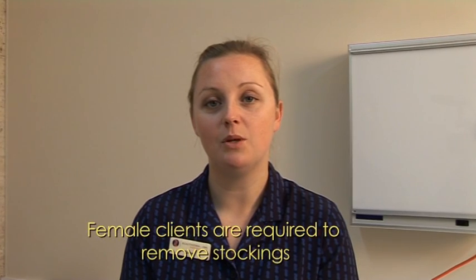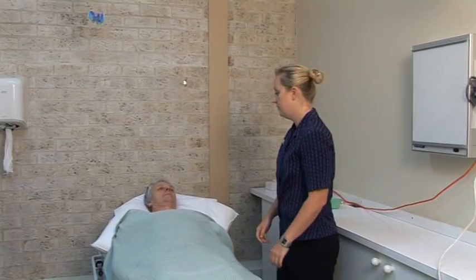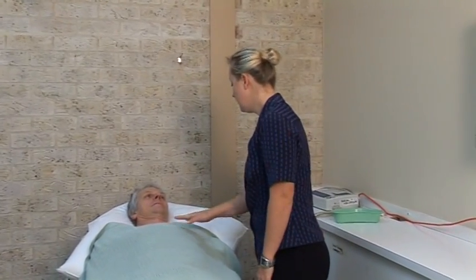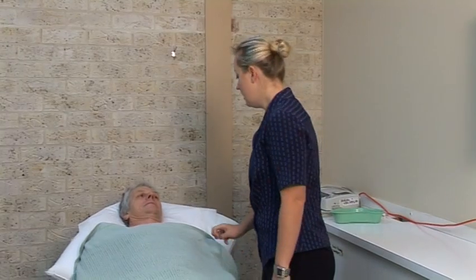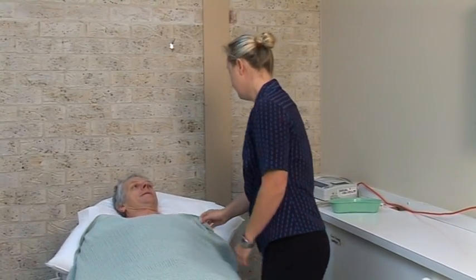Just step onto the scales for me. I'll just get you to pop behind the curtain, remove all your garments from your waist up, hop up on the bed and place the blanket over you. Are you comfortable and warm? Yes, thanks. The collector must explain the procedure to the client to ensure that they are not nervous, because a nervous or cold patient could result in the ECG reading being inaccurate.